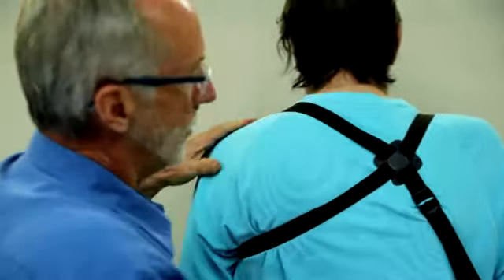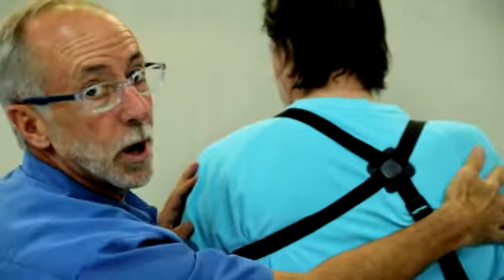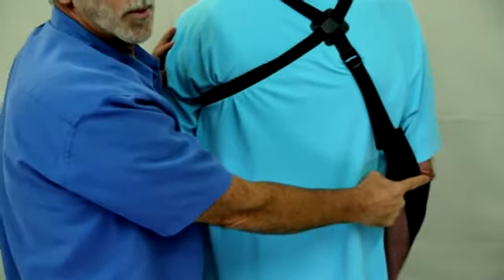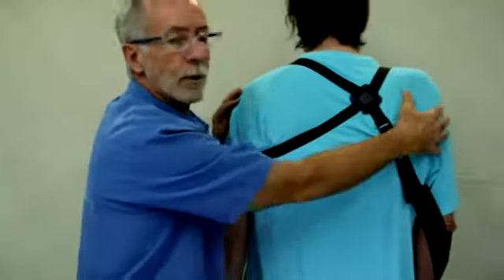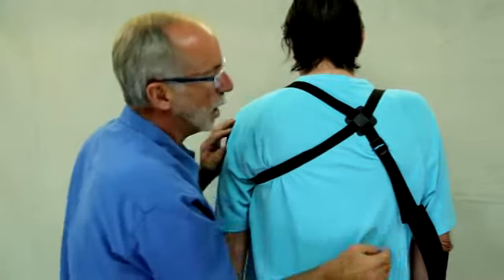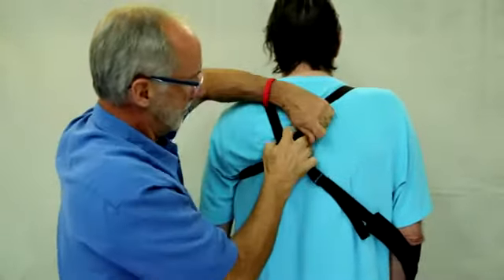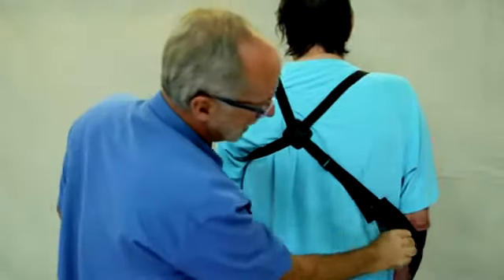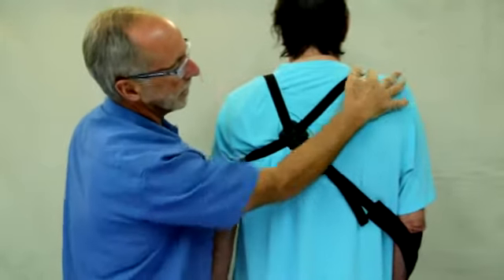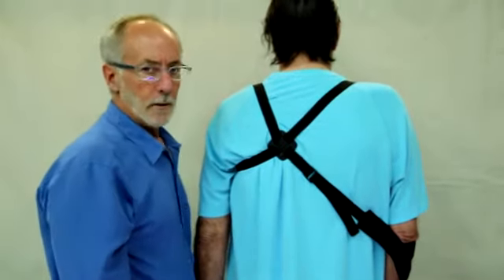The things to watch out for — and this is all a balance — is the further over this way I get, the more likely this strap is to slip off the shoulder, or the more likely the elbow is to slip out of the elbow pocket. So if I have a person with really rounded shoulders and the strap keeps falling off their shoulder, or we're having problems containing the elbow, then I might want to do just the opposite. I might want to come way over to the other side, maybe not as high, but down here — and then you see I've got a better angle of pull, so I'm capturing the elbow better, and the line of pull, instead of coming down here, is coming more towards the center, so it's less likely to slip off the shoulder.